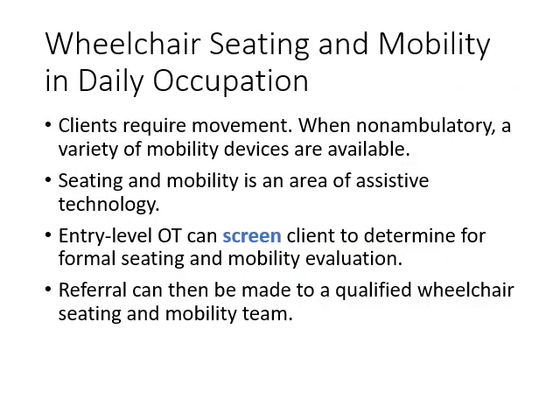So our clients need to move. We all need to move. And if a client is non-ambulatory, meaning that they cannot propel themselves, or they cannot walk with their lower extremities, a variety of mobility devices are available, and our job is to make a recommendation for the most appropriate kind of wheelchair.